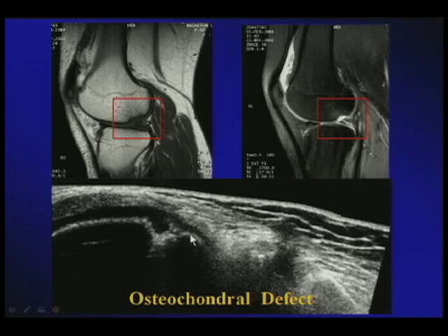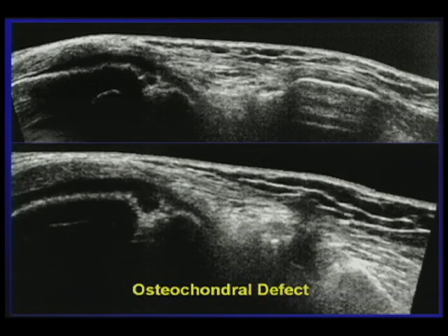Not only that, but you also see the fact that there may be a residual fissure across the hypoechoic regenerating cartilage. Again, you could always take a look at it in a single tomographic slice on ultrasound, or employ the fact that you can move around, try to see the rest of the cartilage.